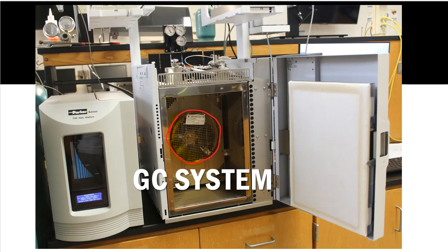That is where our sample is going to eventually go. Right up here at the very top of the GC system, the sample is eventually going to go into that entry point. And if you follow that line down, you're going to see that it leads down into this circle thing that's inside of what, again, we call the oven.